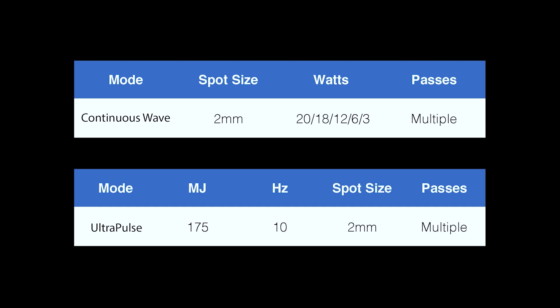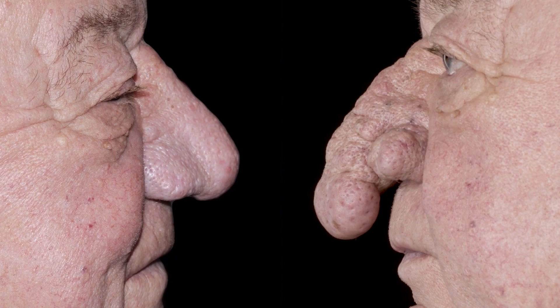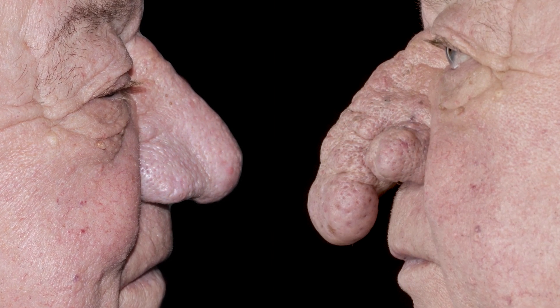The patient was treated with continuous wave mode of carbon dioxide laser using the settings as shown. The overhanging rhinophyma was amputated using the laser before sculpting the nasal aesthetic subunits. At three months, the wounds were completely healed. Good nasal contour and shape was achieved with no scarring. The nostrils were patent and regained their normal posture.